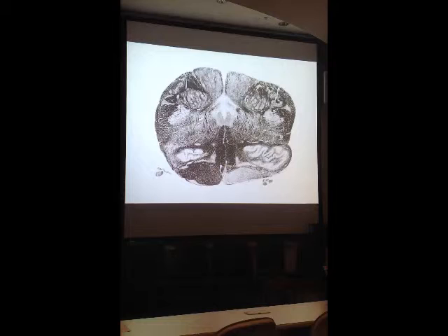Okay, finally then, in terms of brainstem, this is also the medulla. And you should know that because of the standard reason. You have a nice pyramid on the left side. On the right side, we're cutting through still a pretty good section through the inferior olivary nuclear complex. You should know by now that there's still medial lemniscus in this region here. Spinothalamic tract is out in the lateral position out in here.